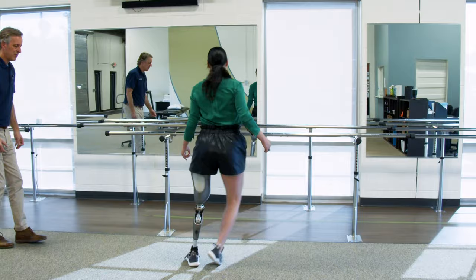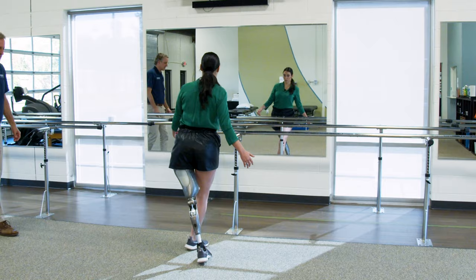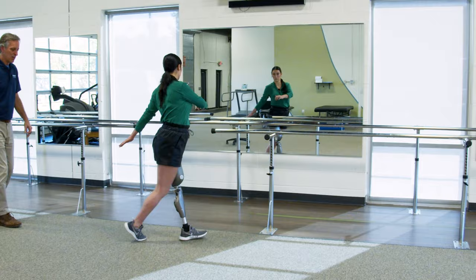Good. Hold right there. Now just cross over towards me. Not speed. Just take your time. And braiding. Karaoke. There you go. Excellent. Good. Braiding away from me. Good. Excellent. Now pick up the pace. Come back towards me with speed. Boom. Boom. Boom. And away from me. Away with speed. Boom. Boom. Excellent. Good. Come back to the center.